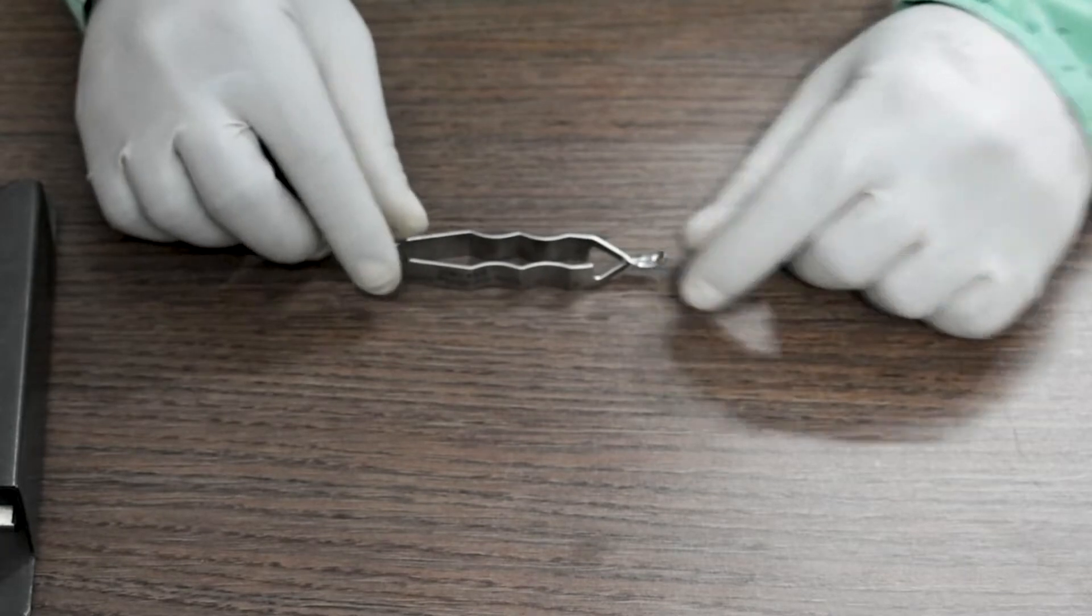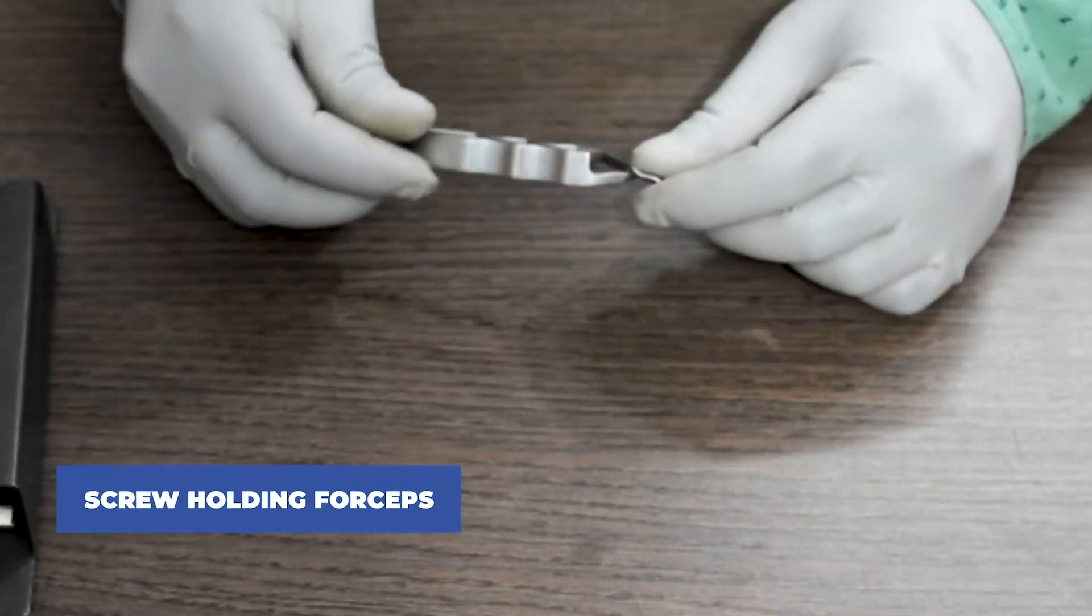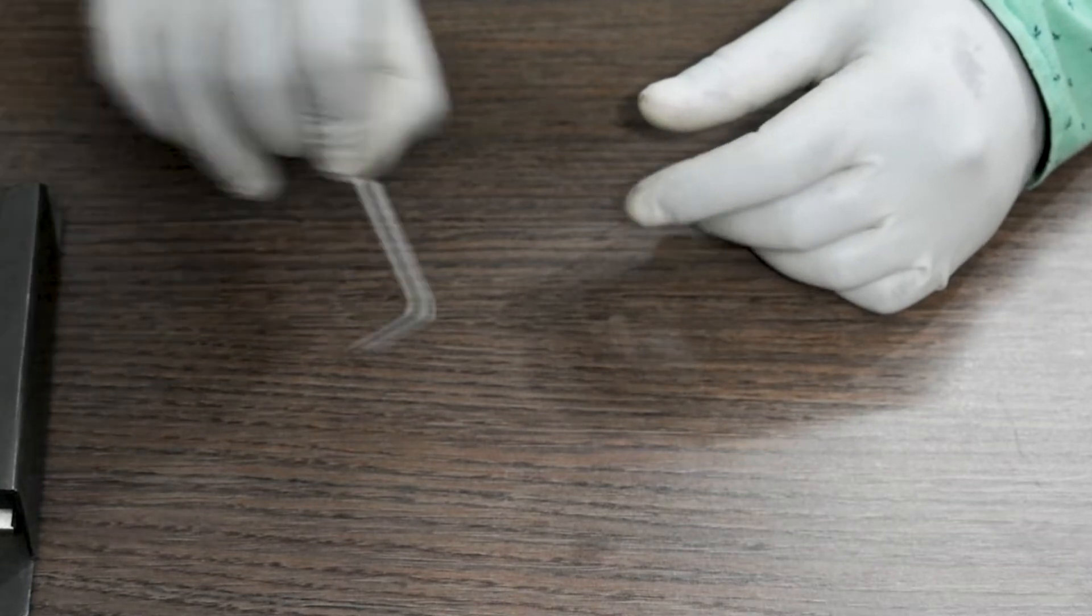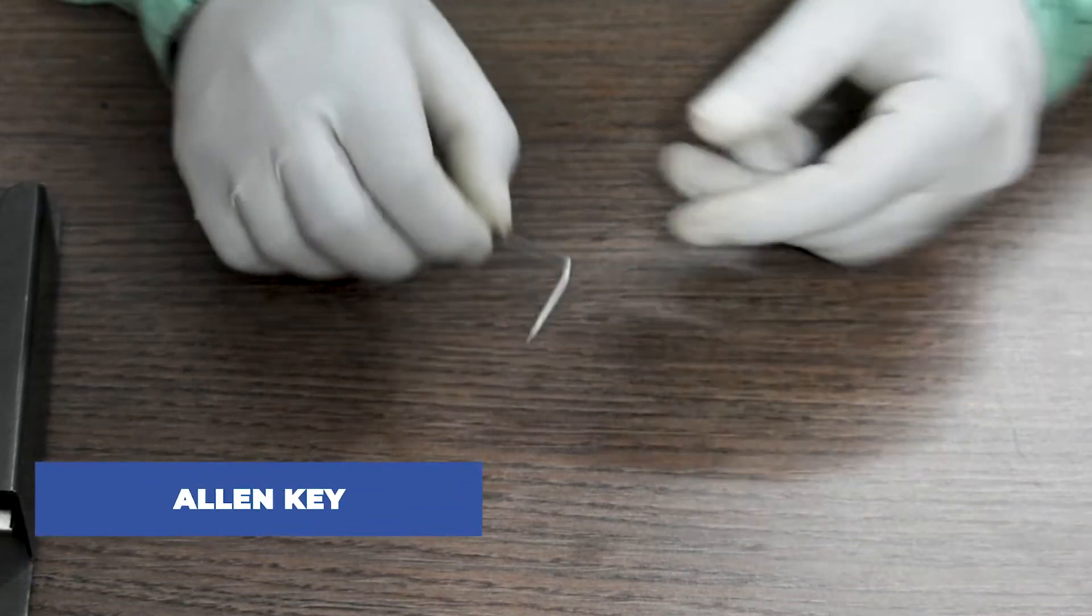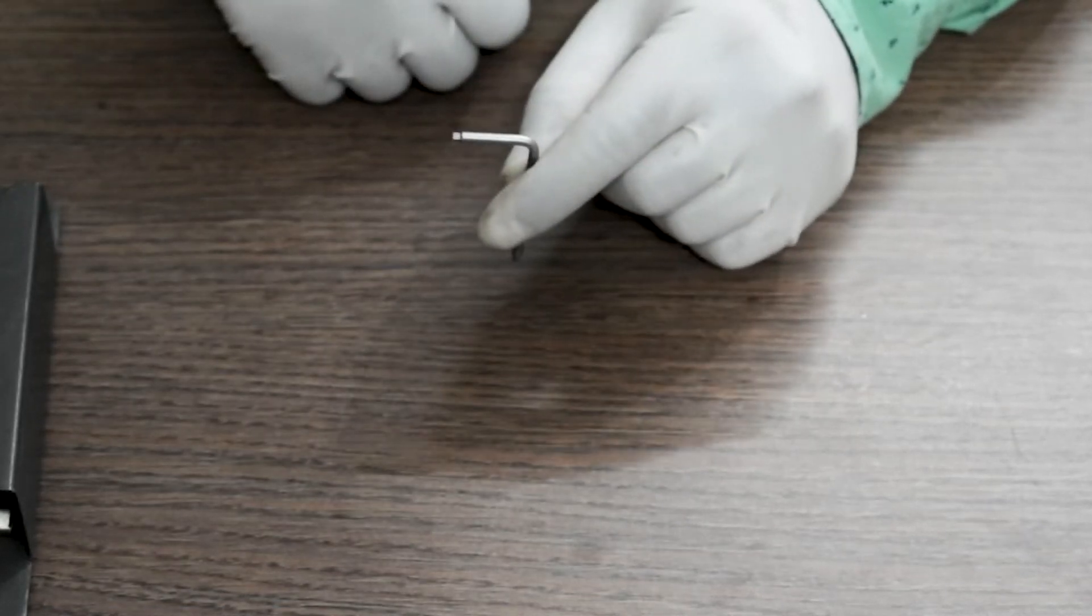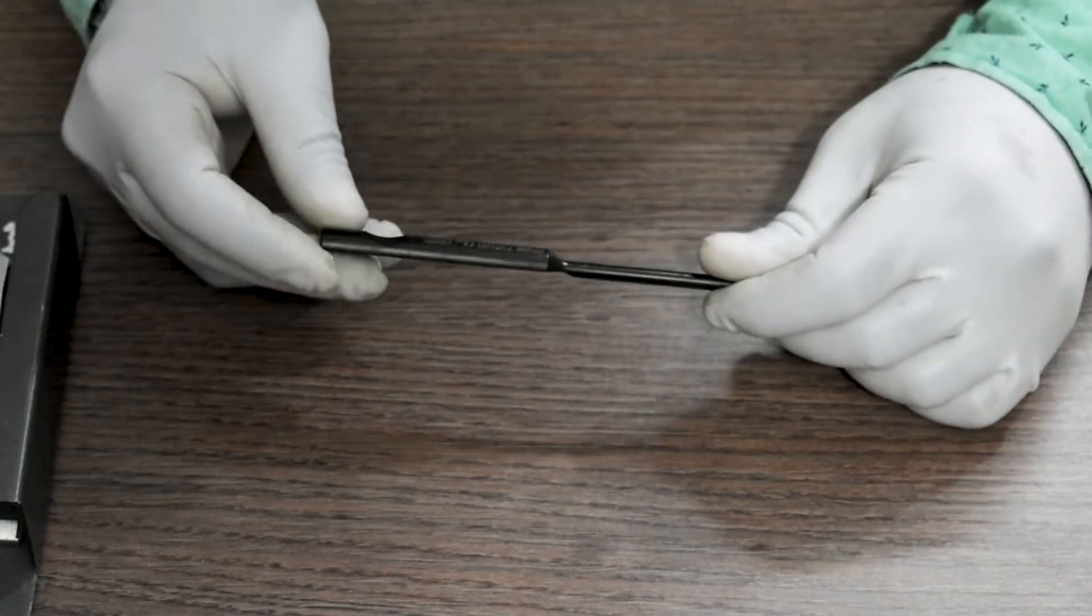These are called screw holding forceps, then Allen key, then measuring scale.